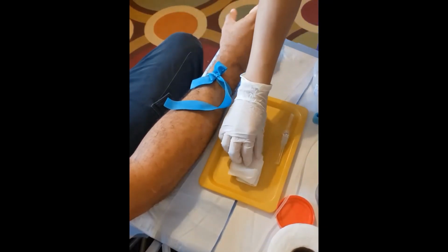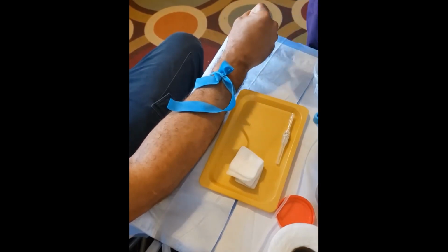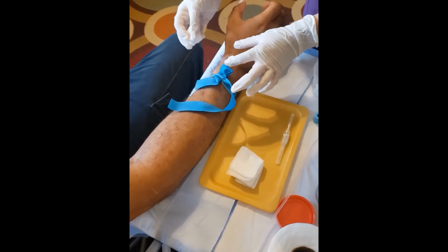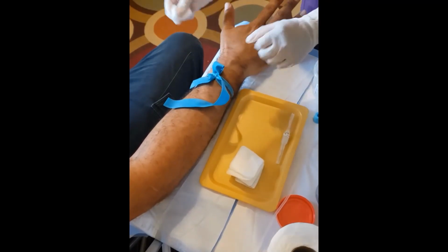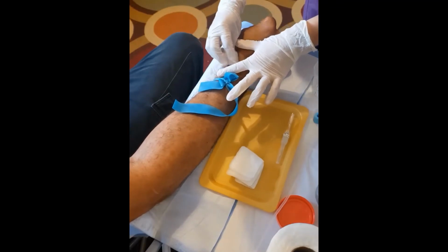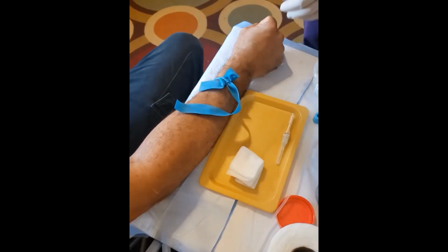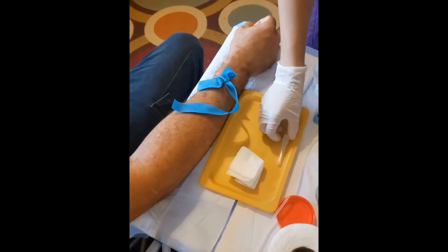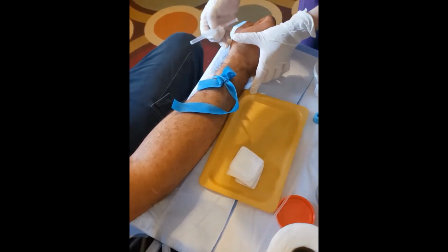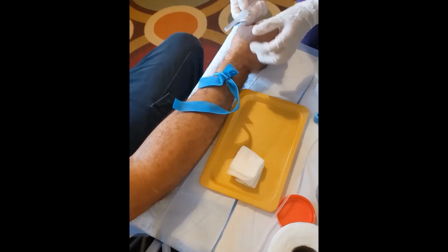If the vein is not sufficiently dilated, you can massage or stroke the vein in the direction of venous flow, or you can encourage the patient to clench and unclench the fist, which causes the contracting muscles to force blood along the veins, distending them. Or you can lightly tap on the vein with your fingers to distend the veins. Avoid vigorously rubbing the vein or spanking the patient, since this causes hemolysis, which can alter labs slightly or significantly, especially in values like potassium showing a false increase.